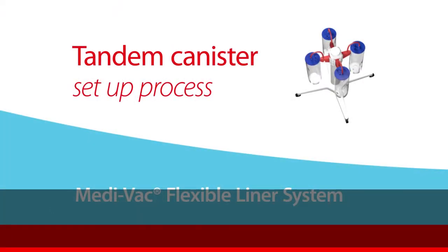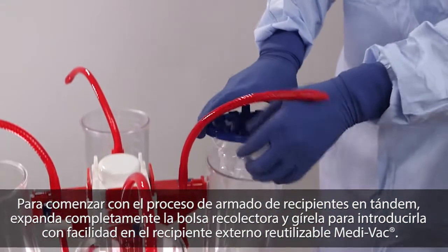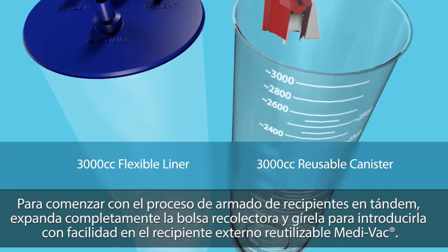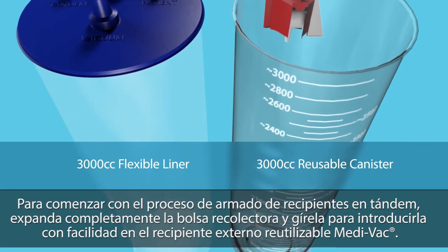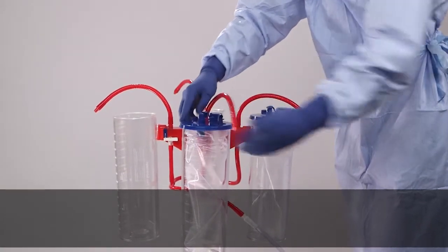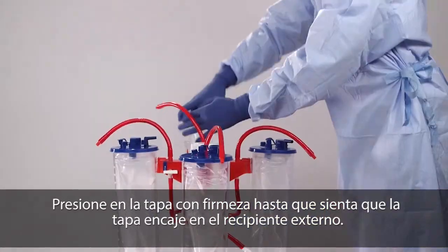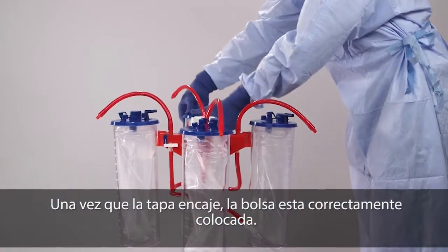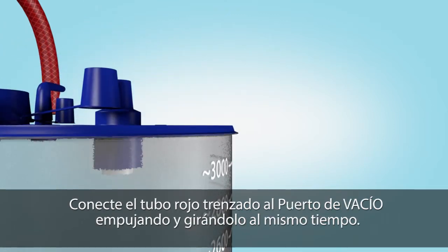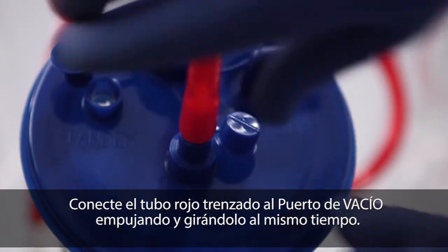To begin the tandem canister setup process, fully extend and twist the flexible liner to enable easy insertion into the corresponding Medivac reusable outer canister. Ensure sizes are the same. For each liner, press down firmly on the lid until you feel the lid tabs engage the outer canister. Once tabs are engaged, the liner is properly sealed.